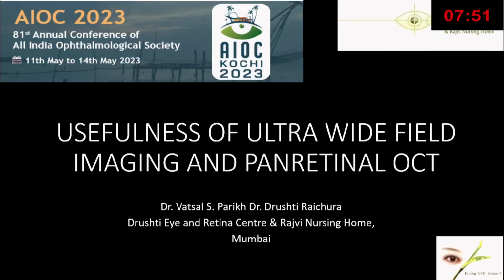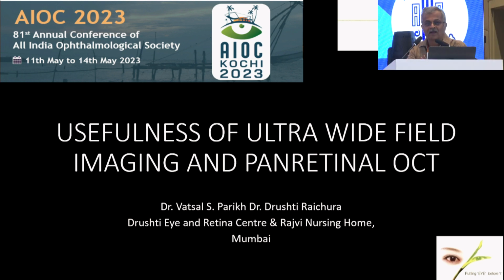Good morning. I thank AIOC and Dr. Nitin Prabhudesai for letting me share my experience with this technology of the Silverstone machine, which has what you have in Daytona: ultra wide field imaging with autofluorescence, ultra wide field FFA, ICG, and image guided swept source OCT.